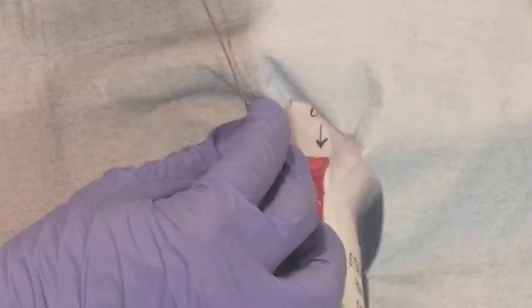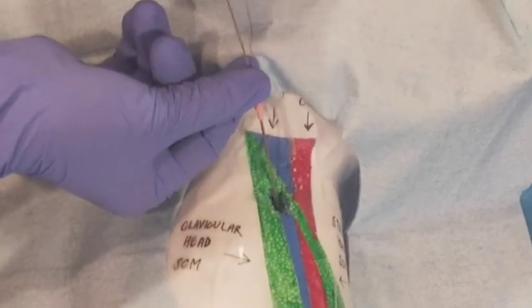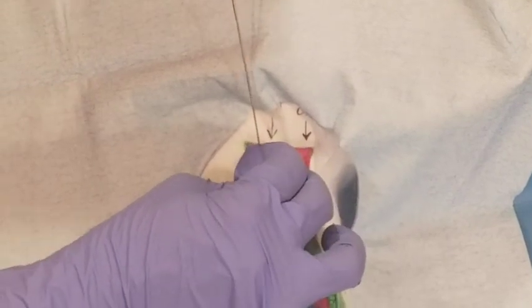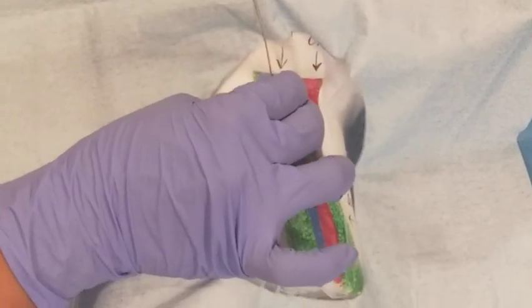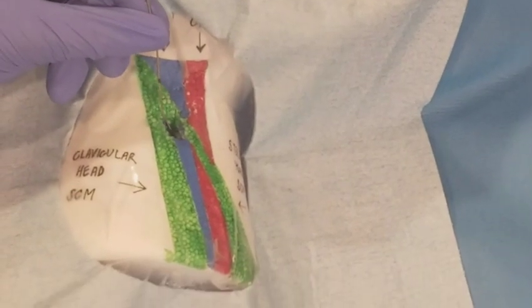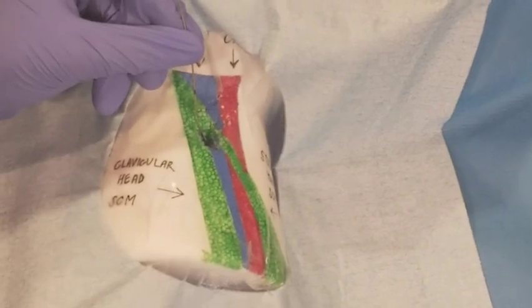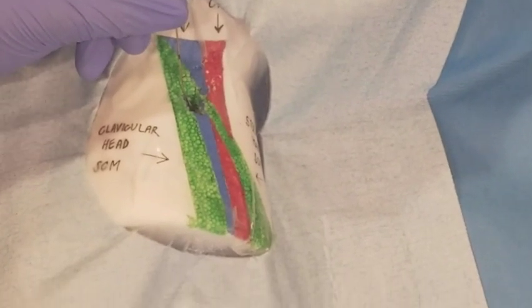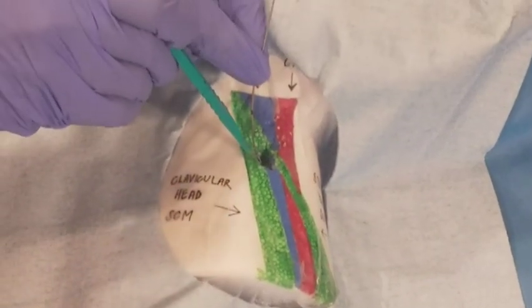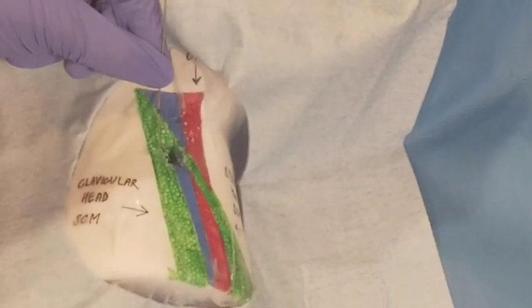Take off the straightening adapter and remove the needle, making sure not to ever lose track of the wire. Now what we're going to do is we're going to use our scalpel to dilate our insertion track. Make an incision there.